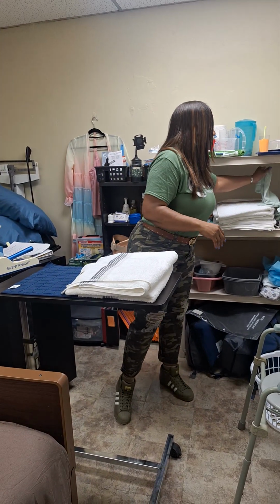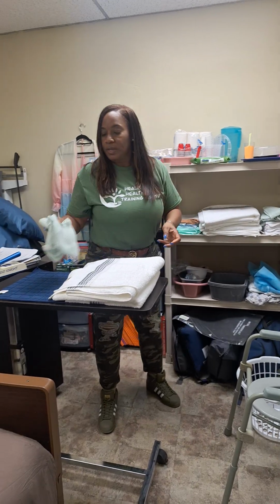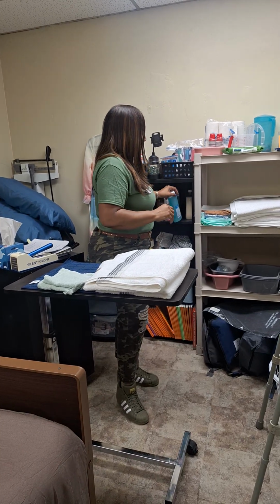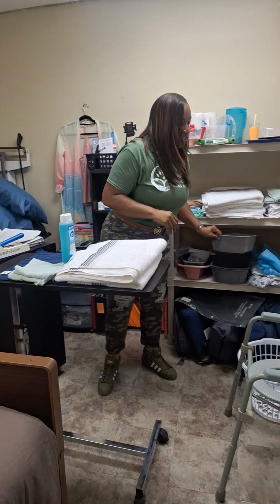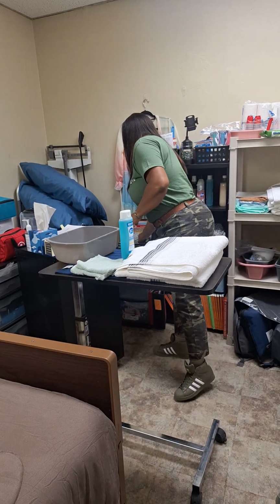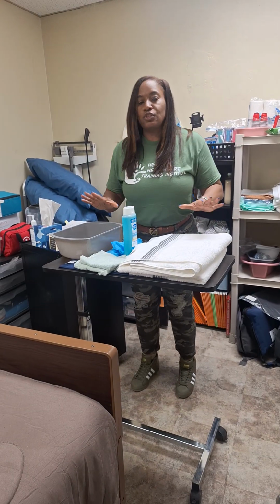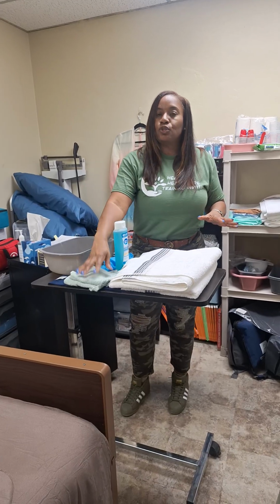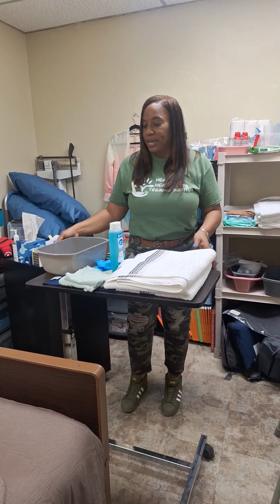You're going to need 2 face towels, one to wash, one to dry. So these are the things you're going to need here. You need some soap. And you need your wash basin. These are the things you need here. And then you need a pair of gloves. So these are the things that you need for this particular skill. You need 2 bath towels, 2 washcloths, soap, gloves, and your wash basin.